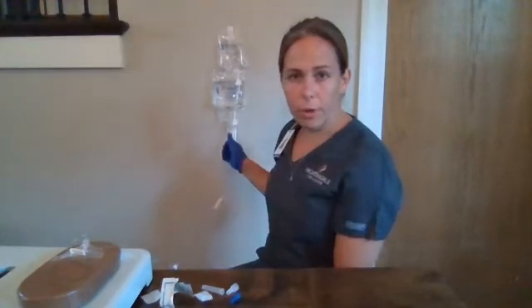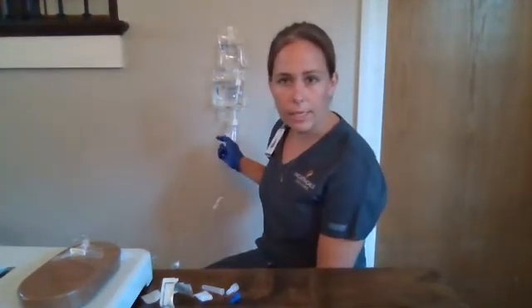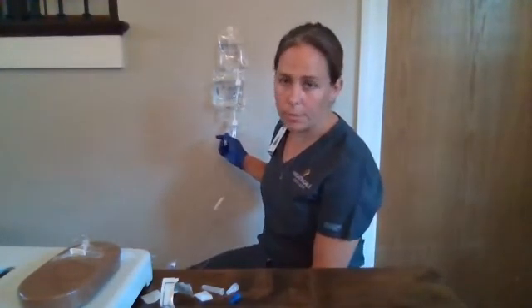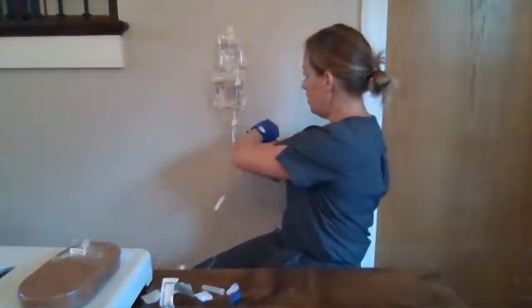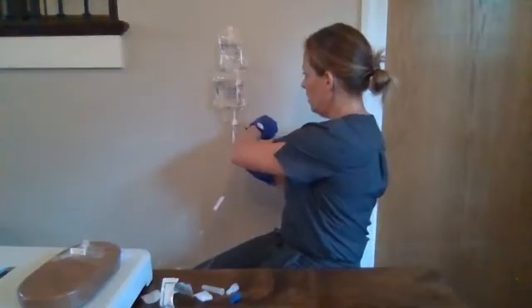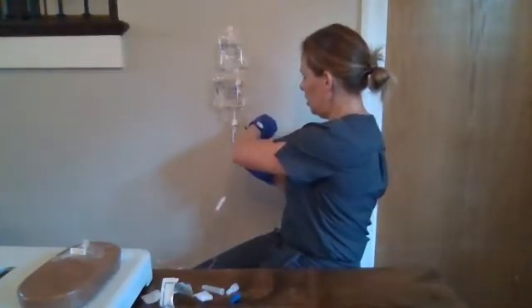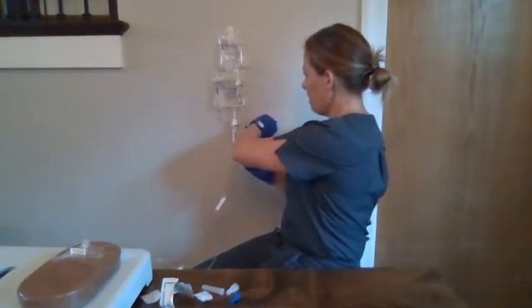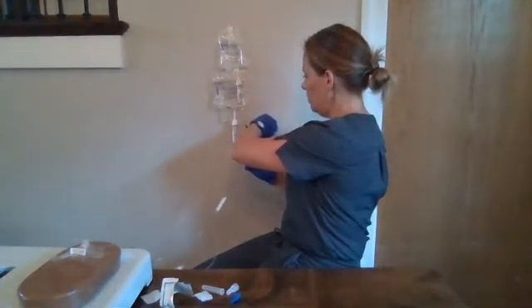We'll go back up to our roller clamp — our antibiotic is going to run at a rate of 100 drops per minute. We will slowly open up our roller clamp until we reach 100 drops per minute, and again we'll count it for the full minute.